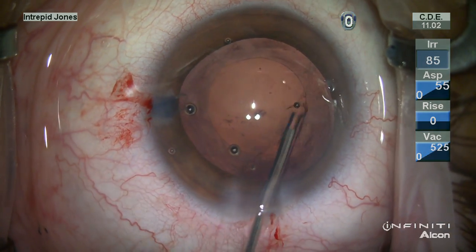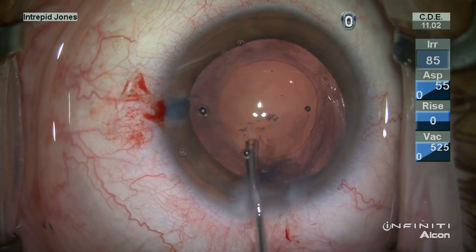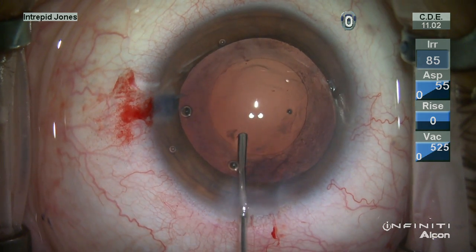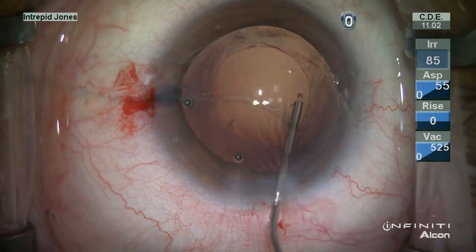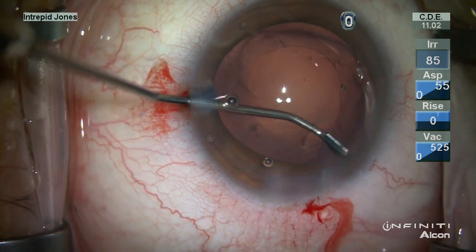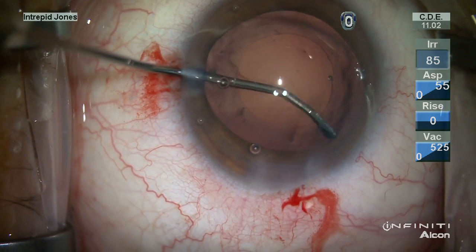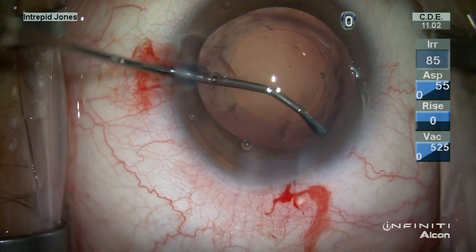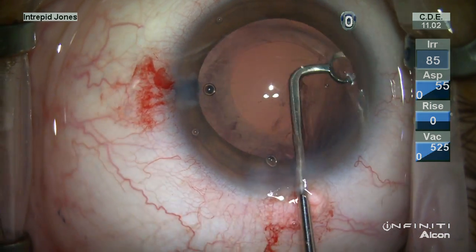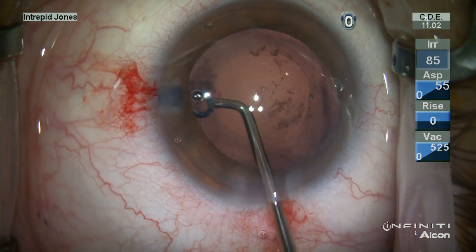The material here of the cortex can be rather sticky and fairly difficult to remove because of the lack of material and the fact that it's more peripheral. We're left here with a band of fibrosis across the posterior capsule and some peripheral capsular plaque as well. Using curettes both on the under surface of the anterior capsule and the posterior surface of the peripheral capsule, much of this material is liberated.